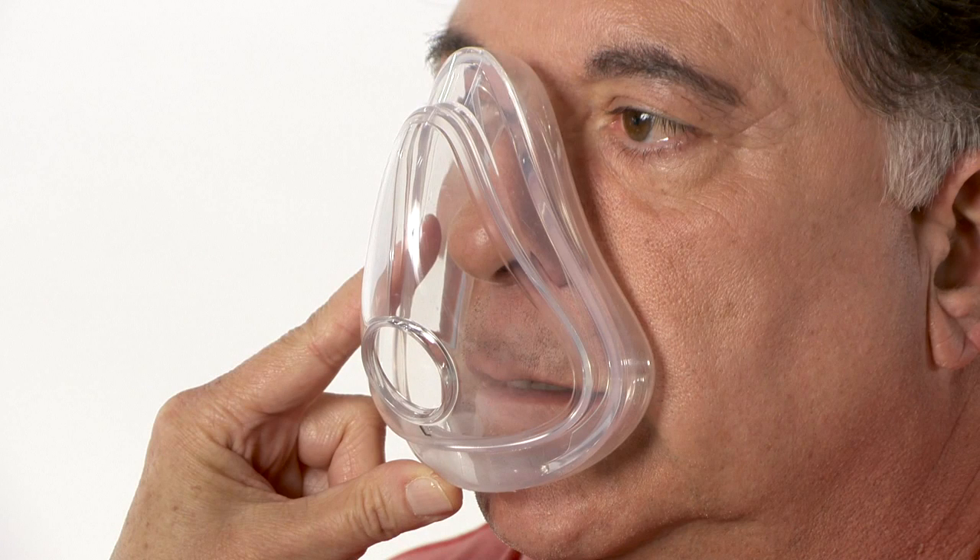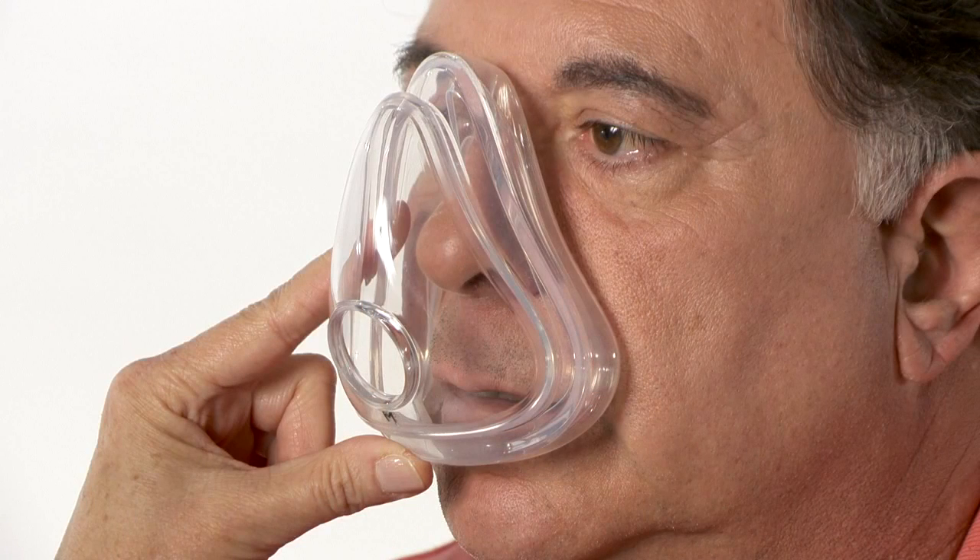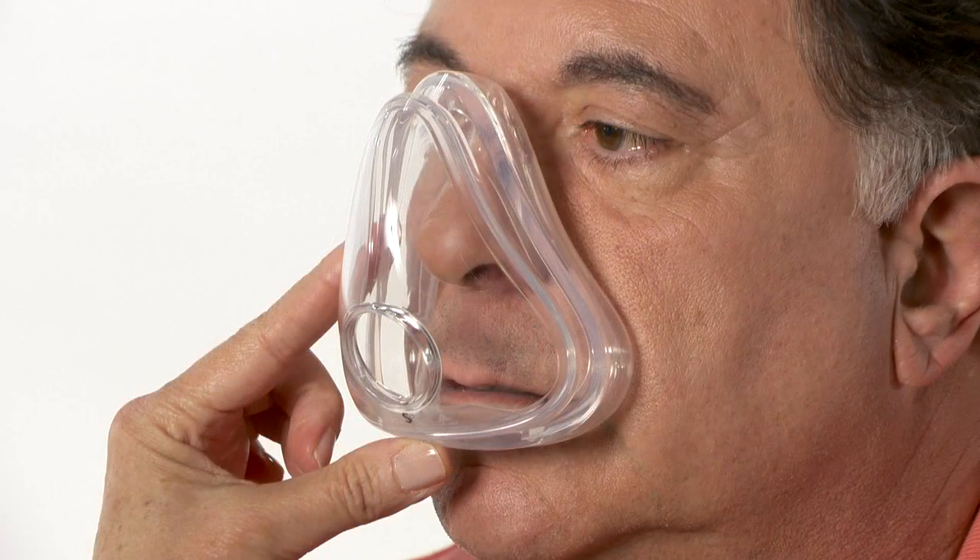To determine which size to use, hold a cushion up to your face. The bottom should rest in the middle of the chin. Choose the smallest size that touches the midpoint of your nose as you keep your mouth slightly open. Another option is to use the Amara sizing gauge. The bottom of the gauge should rest in the middle of the chin with your mouth slightly open.